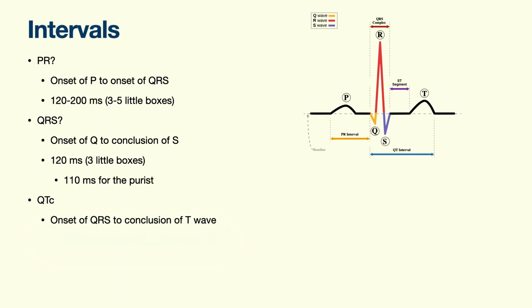How much is normal? Not totally clear. Women seem to have a little bit longer QT intervals than men. I don't think anyone really knows what normal is. I at least don't. But why do we care about the QT interval? What's the thing we're worried about? Torsade. It's like the torsadometer, right?